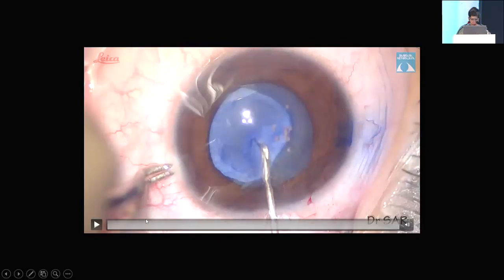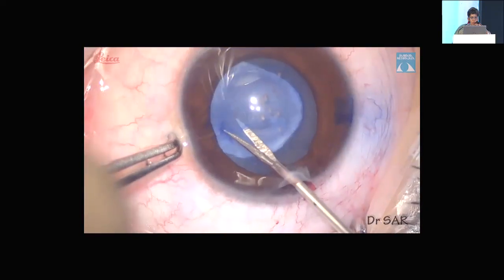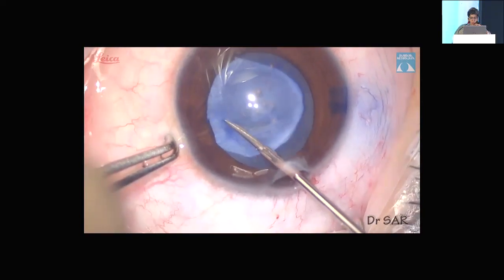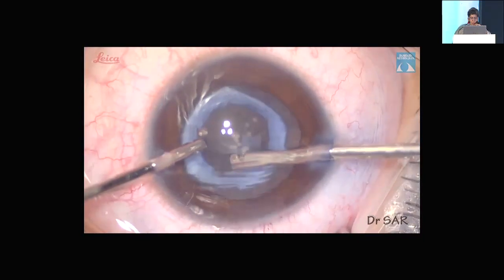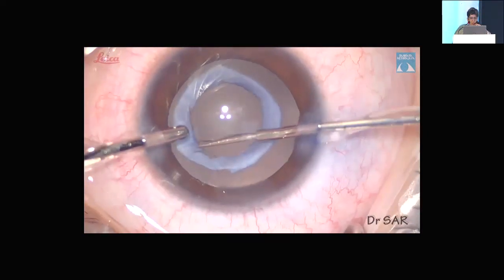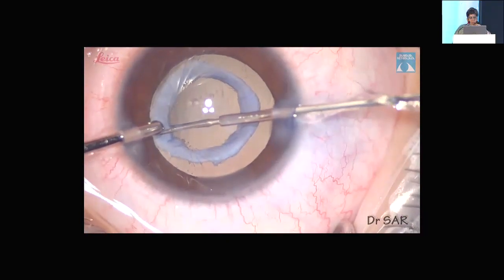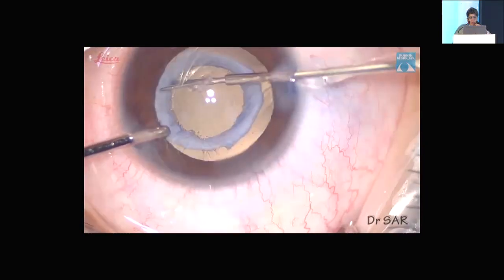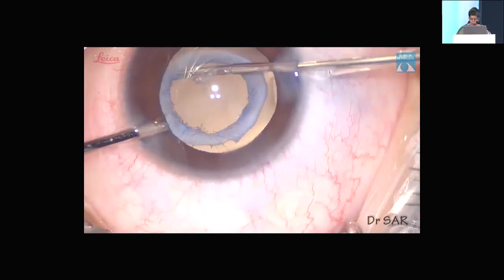Sometimes you will run into trouble with a fibrous capsule. As you can see here, even for a small entry you may have to use micro scissors and actually cut the capsule into adequate shape. One good thing about these fibrous capsules is that the tendency to run away, as long as you stay in the fibrous area, is very minimal. You can enlarge it after making radial cuts, and use a retractor to slightly enlarge it to an adequate size. This is as safe a bag as it can be.